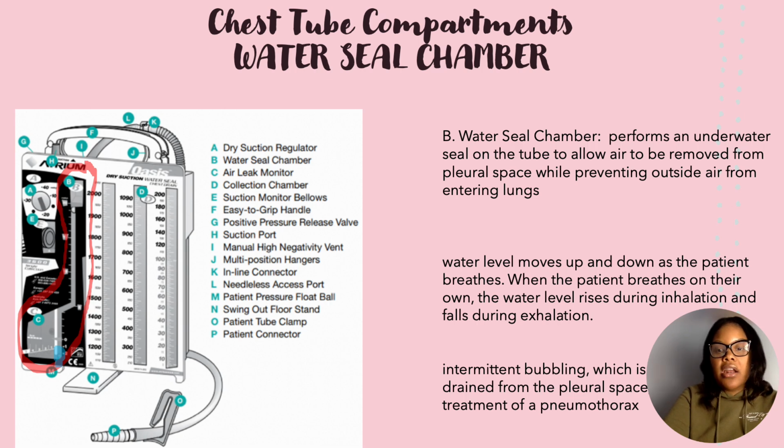In the skinny part, there's going to be a little tiny ball sitting in water. As the patient breathes in, that ball is going to rise, and as the patient breathes out, the ball is going to fall. So you're going to see an up and down, which we call tidaling, as that patient breathes in and out. And that is going to happen in your water seal chamber.